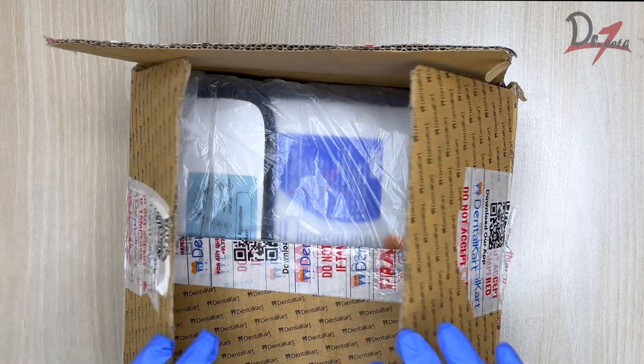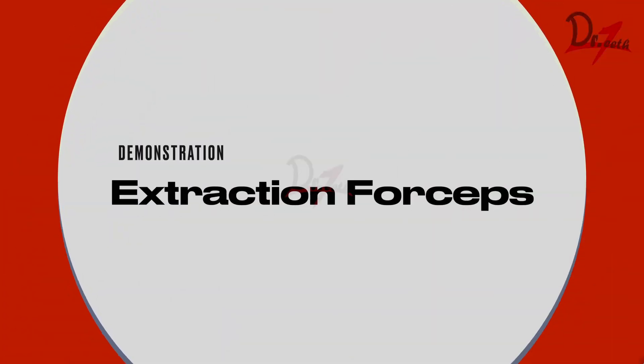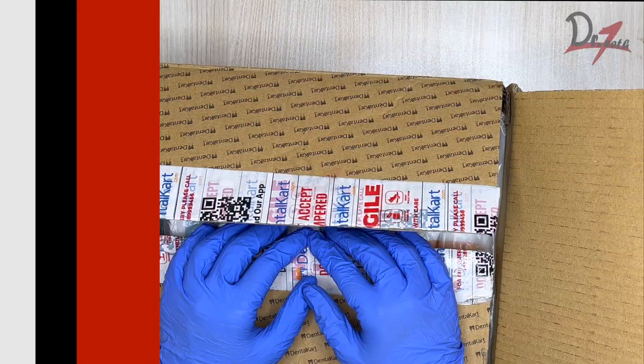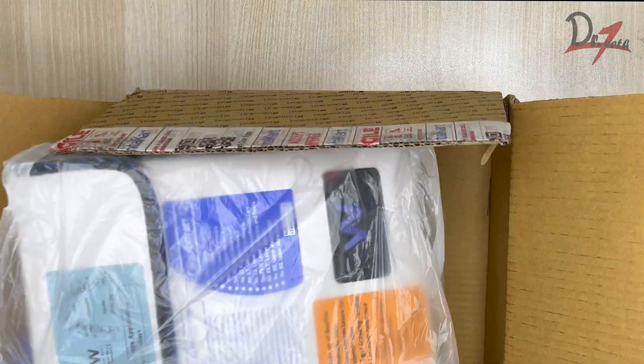Assalamu alaikum everyone. Today we are going to unbox an extraction forcep kit that I have ordered. We are going to learn about the various types of extraction forceps, where to use them, how to use them, and we'll have a demonstration on a typodont. Six years ago I had made a similar video, so hopefully this video is going to be better than the previous one.